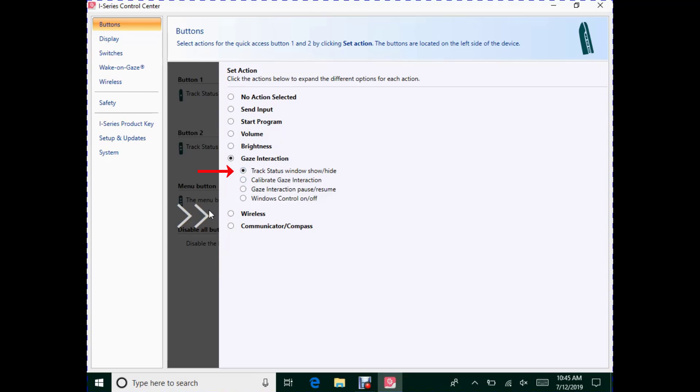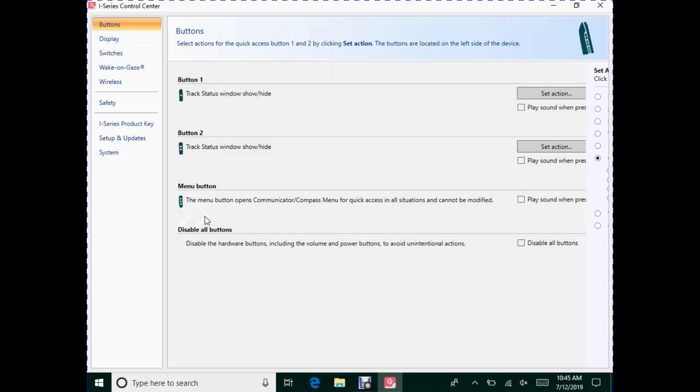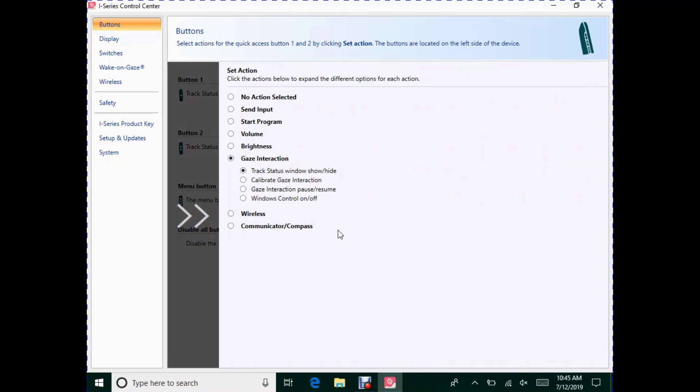Hit the Arrows to go back and select the action for Button 2. The next most used is the Gaze Interaction Pause Resume.